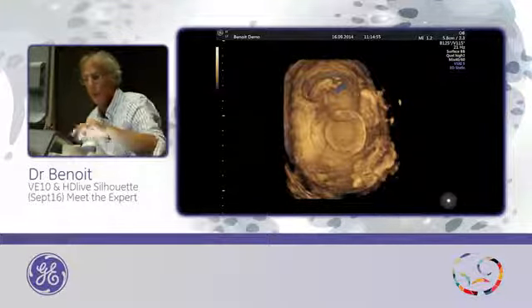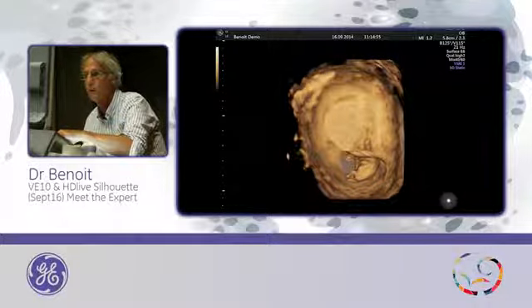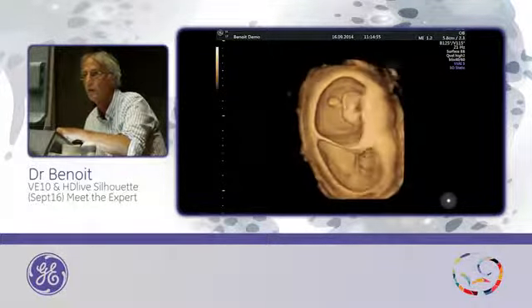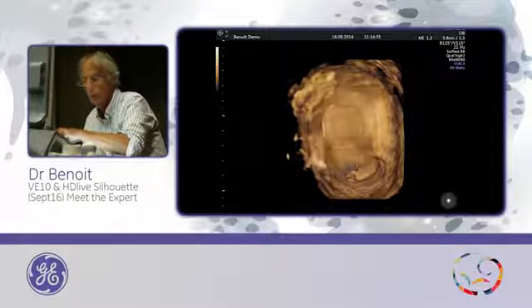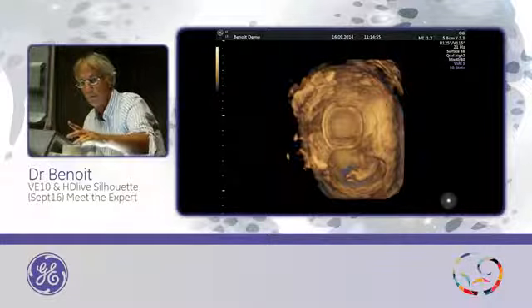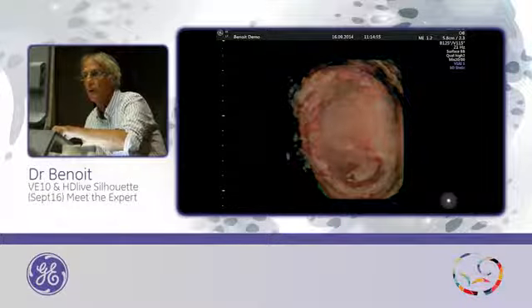Okay, I do the same. First, I start with a classic 3D rendering, one embryo, the other gestational sac, and the second embryo. I switch to HDlive. This one. Increase the silhouette.